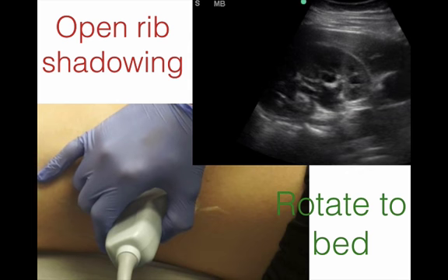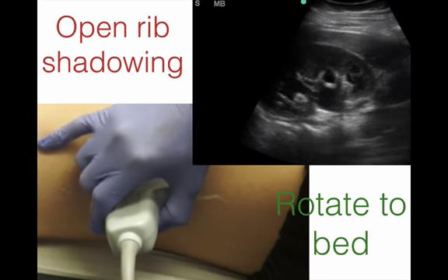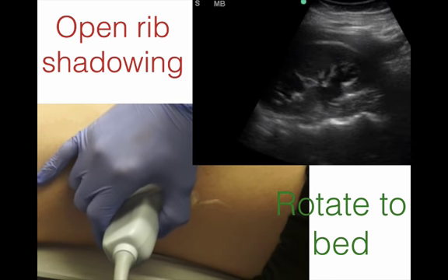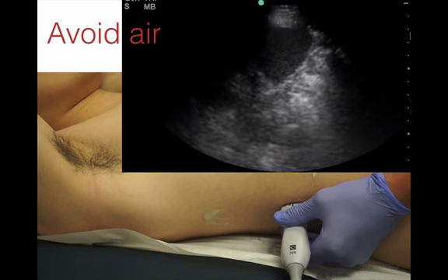So rotate the indicator dot to the patient's bed and you'll see that the rib shadowing will actually spread out. Now you can definitely get air artifacts, and again air will look like this, which is bright white and crinkly. You'll see sometimes liver or spleen up above, and then all this is just bright white. And you know that that's air artifact, and in order to get rid of that, again, you just want to either tilt the probe a little bit more posteriorly or actually slide down posteriorly.